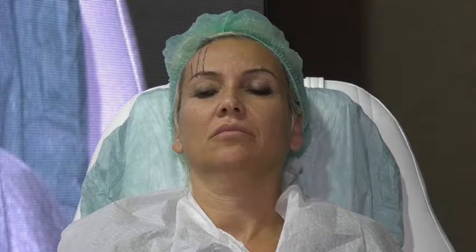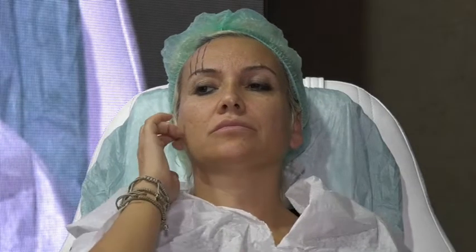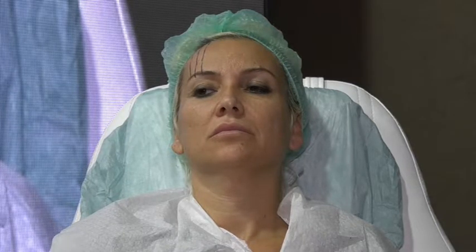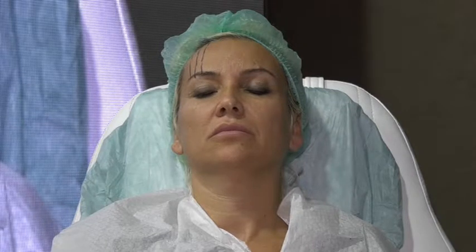Volume. When you collect the threads, you will see a little bit of collection of the skin and hair. If the threads are meeting at one point, you will not have left; you will have a kind of volume here. Do you need a volume in the eyebrow? That means you have to go straight. Don't collect the threads of the eyebrow, please.